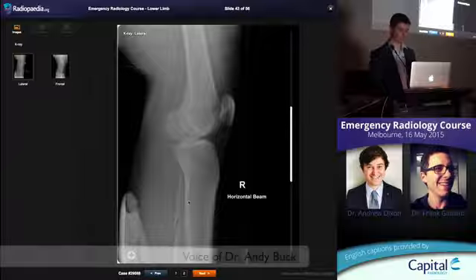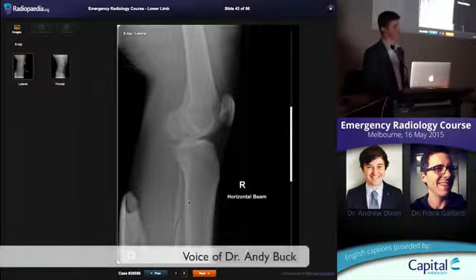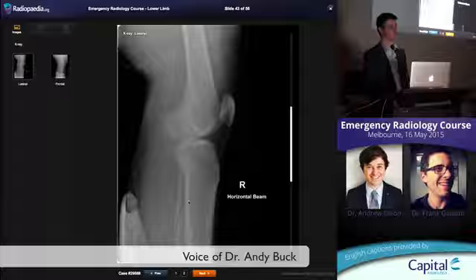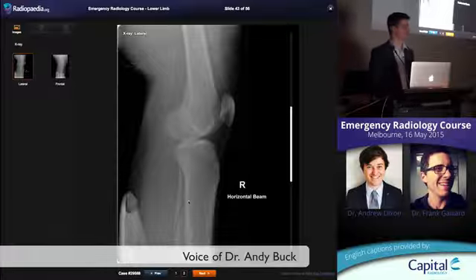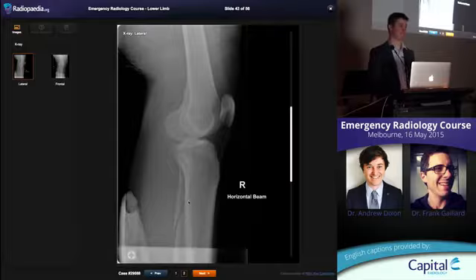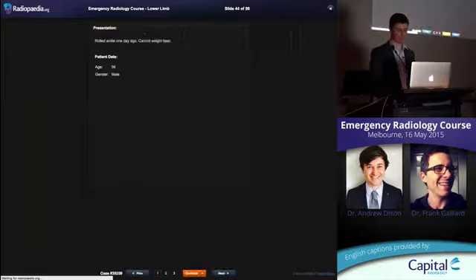And I really want to reiterate that point, because this is a common morbidity, mortality meeting X-ray that comes up, is people, when you get the sprained ankle in fast track now, everyone gets rushed in to see the patient. Can you just order an X-ray for this patient? Everyone just examines the ankle. When you examine an ankle, part of your ankle examination is palpate the proximal fibula. You'd be amazed the amount of times people go, actually that's a bit sore. X-ray the whole thing and you'll pick these proximal fractures. Don't just focus on the ankle.